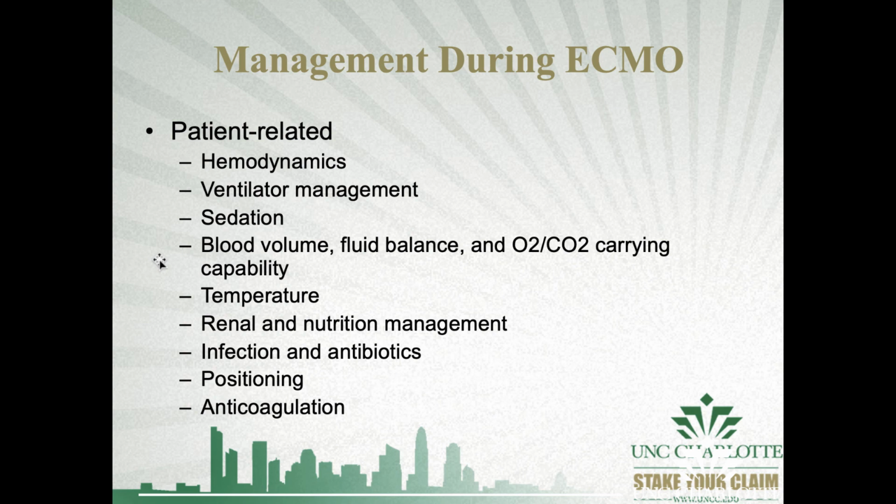We want to have our patients adequately sedated, even though I just said we can exercise them. Our very, very sick patients, any sort of increase in blood pressure or sympathetic activities can affect our pump flows. And agitation, moving around, you can affect your pump flows in that sense with cannulation dislodgement, cannulation movement within the vessel. It's really not a good thing to have. And when we have a lot of suck down or vessel damage, we increase our risks of hemolysis.